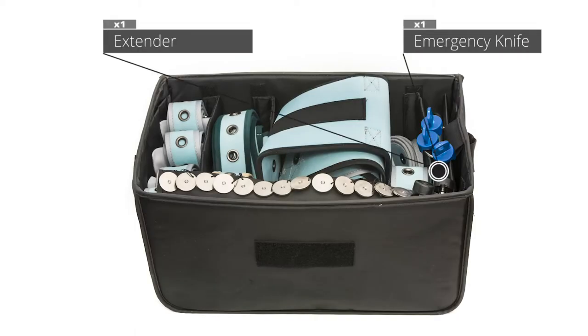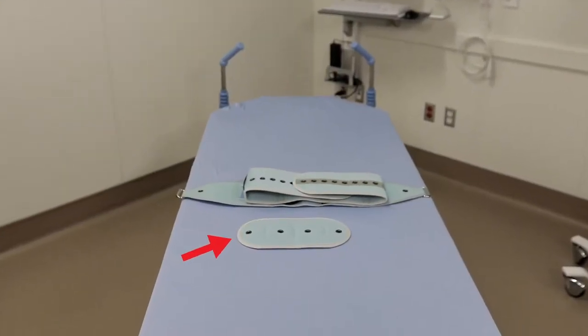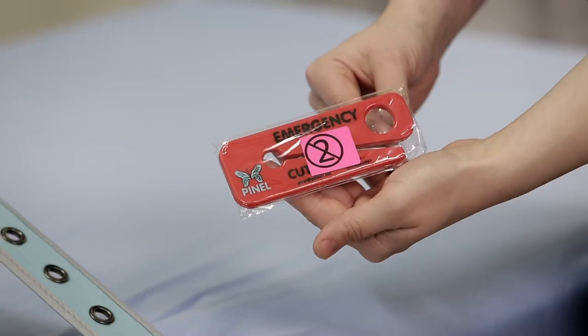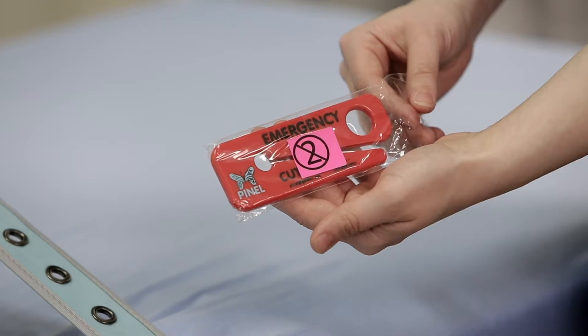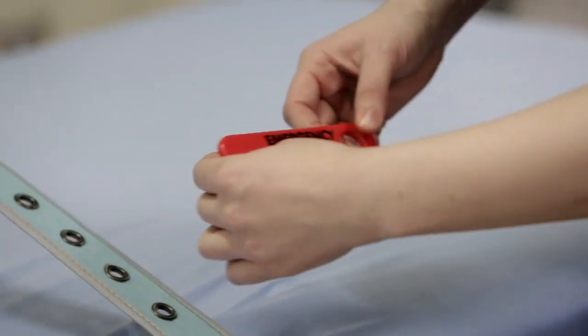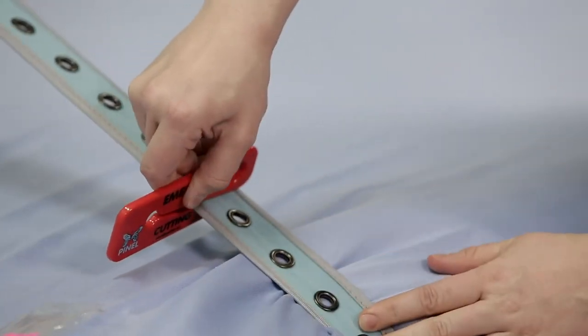The last slot to the right contains the extender, along with a red emergency cutting knife. The extender lengthens the waist belt by 10 inches or 24.5 centimeters. The emergency cutting knife is used to cut ligatures quickly. Since it should only be used during an emergency, it must be kept at optimal sharpness. Pinel has therefore labeled it as a one-time-use item.